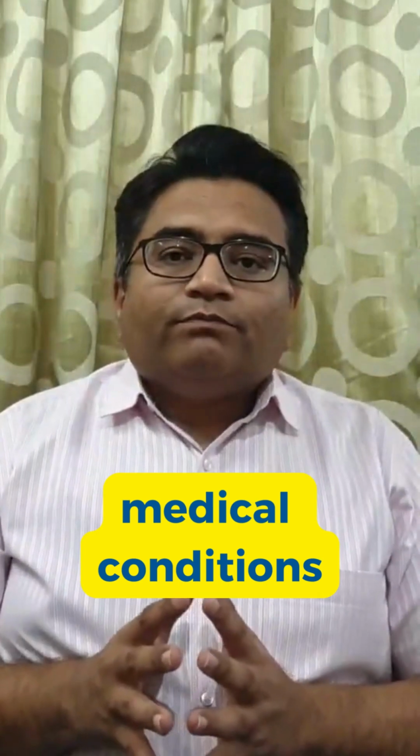The report of your endoscopy procedure will be given by the doctor on the same day. However, if he has taken a biopsy, then that biopsy report will take at least 3 to 5 days to come, and the doctor will discuss it in detail on your next follow-up.